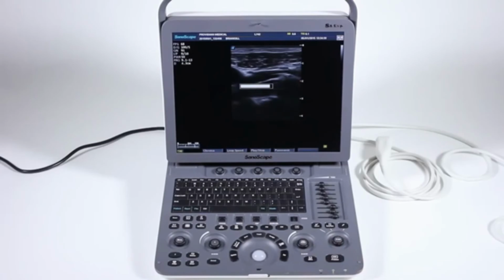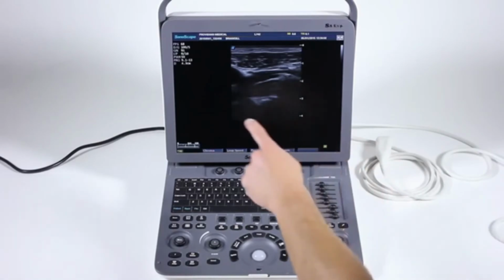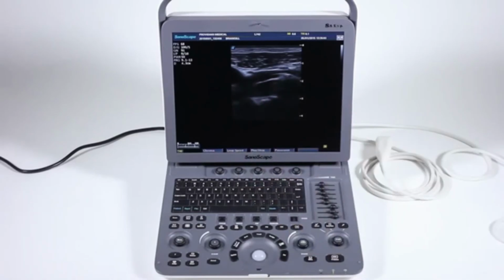Sometimes you have to press that twice, particularly in color Doppler, pulse wave Doppler. In some situations, if you press and hold it, you notice it won't save. This may be changed in a later version, but with this particular version, occasionally you'll find you need to press and hold it twice. Make sure you see that progress bar and hear that sound before you're sure that it is saved to the hard drive.